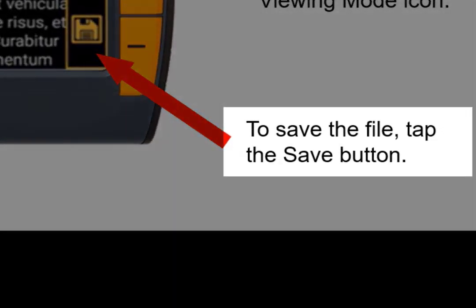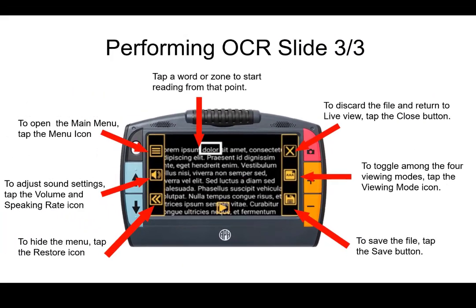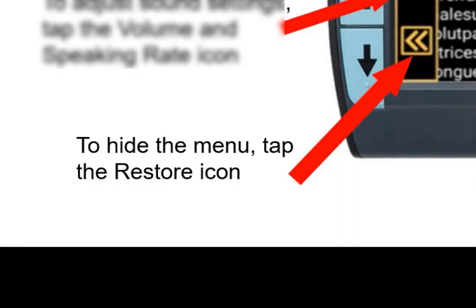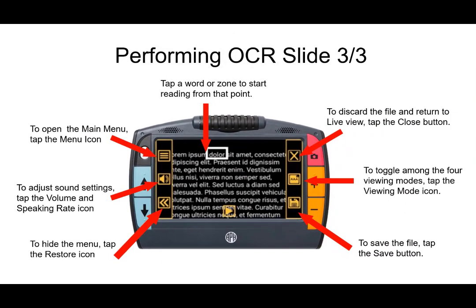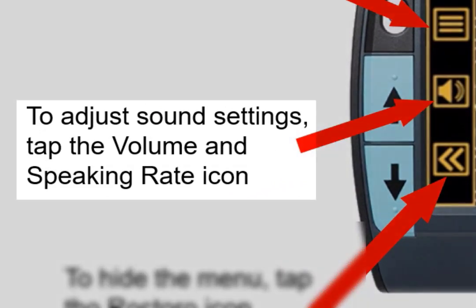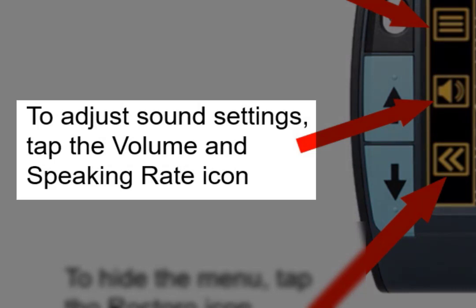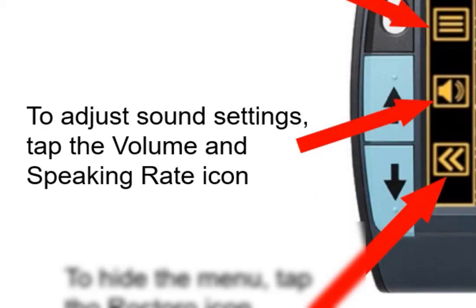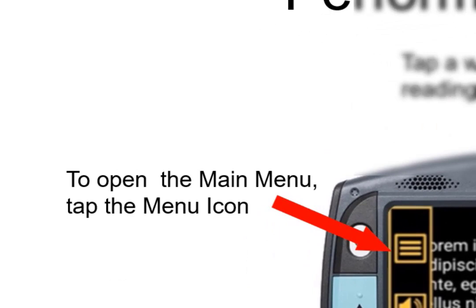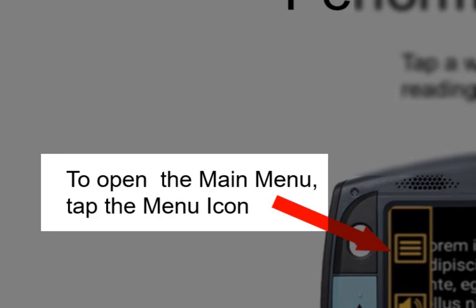In the lower right, tap the save button to save the file. In the lower left is the restore button — if you want more room to read text visually with less clutter or to follow the visual indicator, you can collapse those menus. In the middle left, you can adjust sound settings by tapping the volume and speaking rate icon, which works the same way as discussed in a previous video. The final button in the top left is the main menu button, if you need to access the main menu.